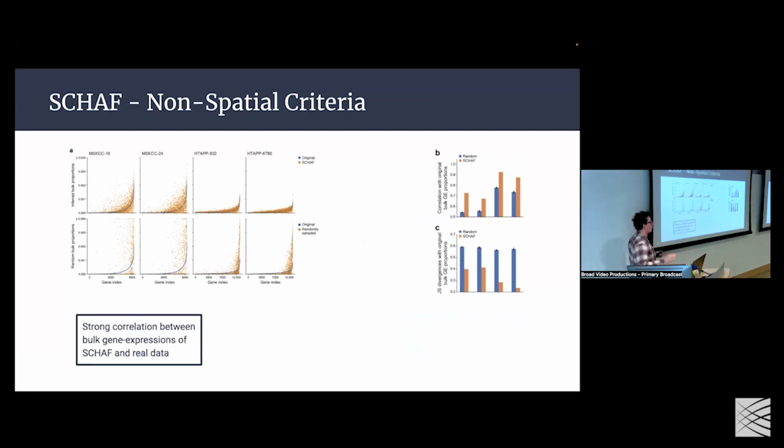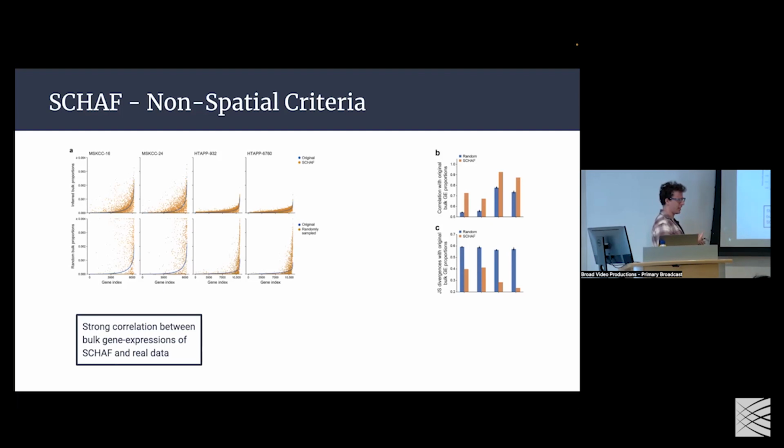And in terms of how well we do, this is our first kind of demonstration that the method works. For each of these corpora, we'll roughly divide it so that 75% of the samples will be used for training and 25% will be used for testing.